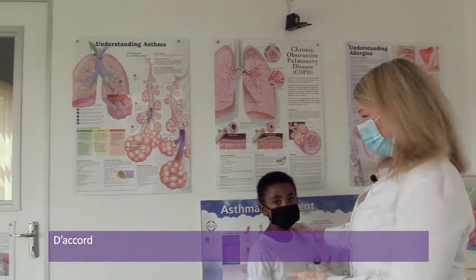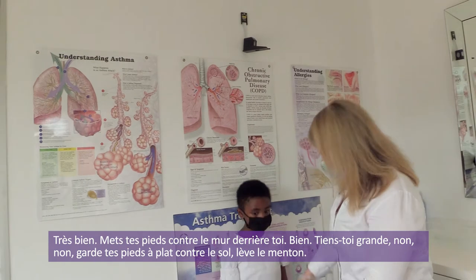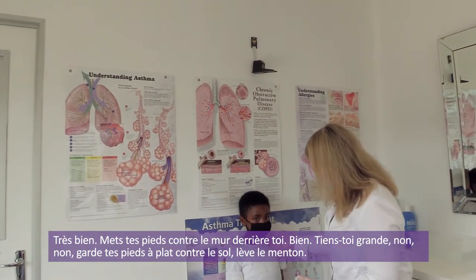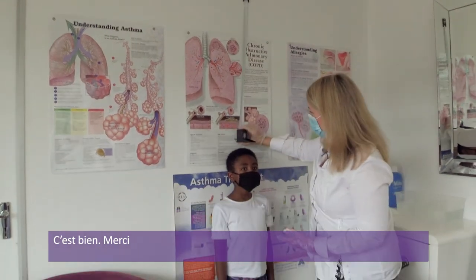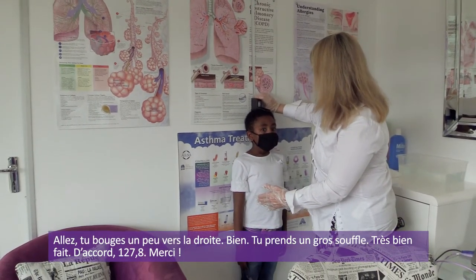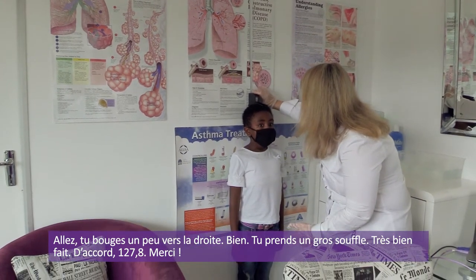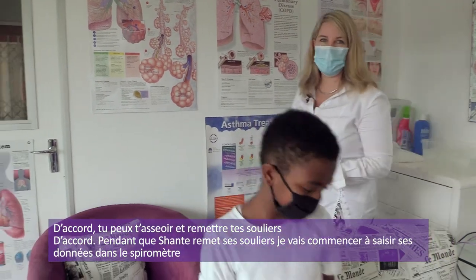All right, good. Super. Put your feet back against the wall. Good. Make yourself tall. Keep your feet flat on the floor. Put your chin up. Good girl. Thank you. Just move a little bit to the right. Right, take a deep breath in. Well done. Good. Okay, 127.8. Thank you. Okay, you can take a seat and put your shoes on again.